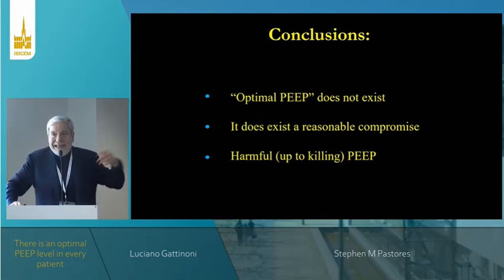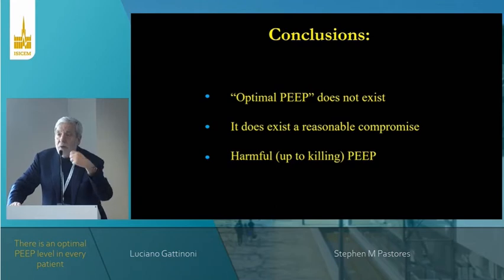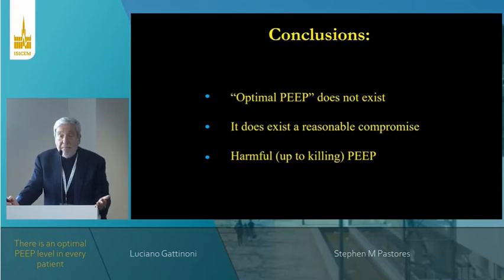So I'm far more interested in avoiding damage. Anytime I touch the knob, is this setting more or less dangerous? This is the question that we have to answer, and then to accept a compromise, as in many other aspects of our life.